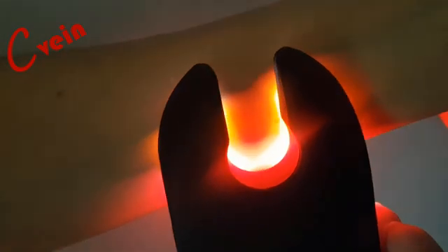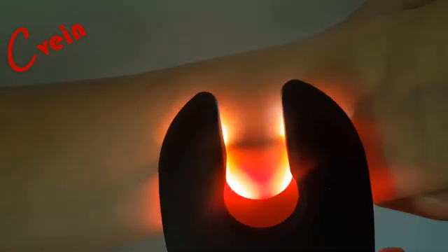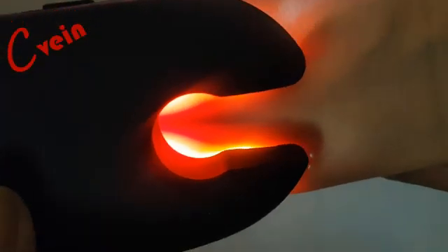Keep C-Vein touching the skin surface. Find a vein by scanning perpendicular across the arm. Once the vein is located, rotate the device parallel to the arm and then cannulate the vein. Try to perform the procedure in as little ambient light as possible for better visualization.